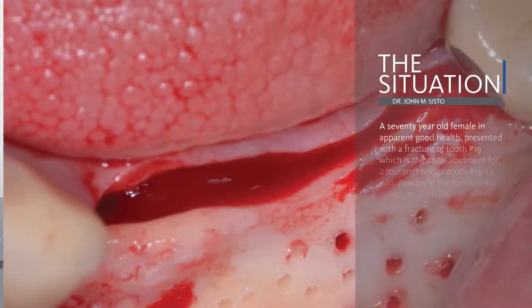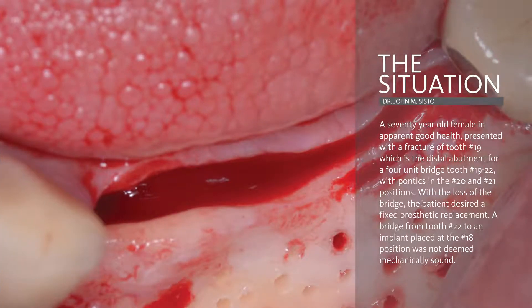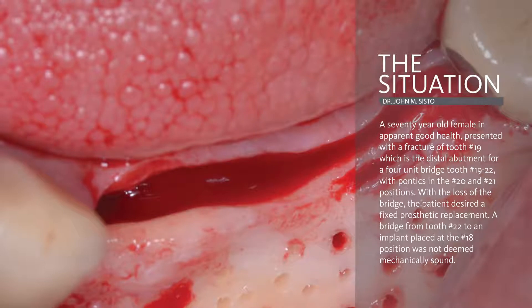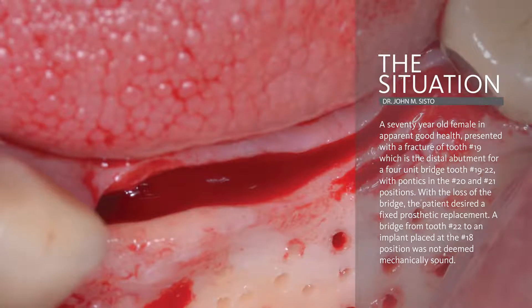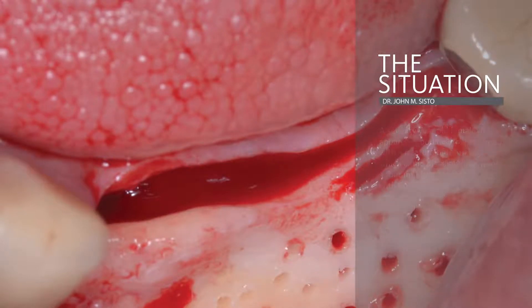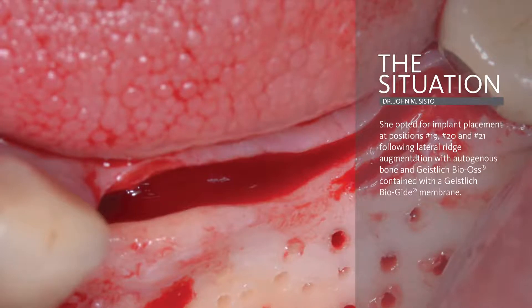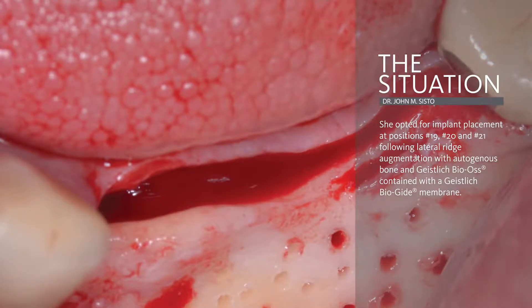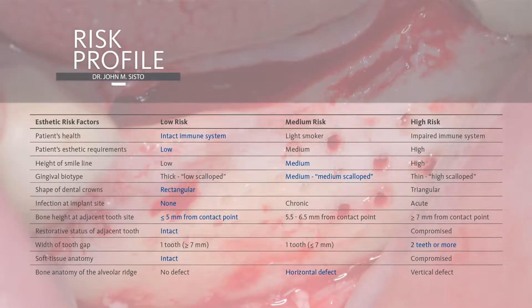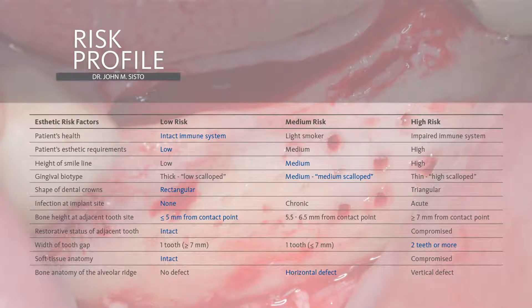This bio-brief examines a case of a 70-year-old female with missing teeth 19, 20, and 21. The residual ridge is very atrophic, requiring horizontal ridge augmentation prior to dental implant placement. The patient has a relatively low risk profile, except for the fact that the defect spans three teeth.